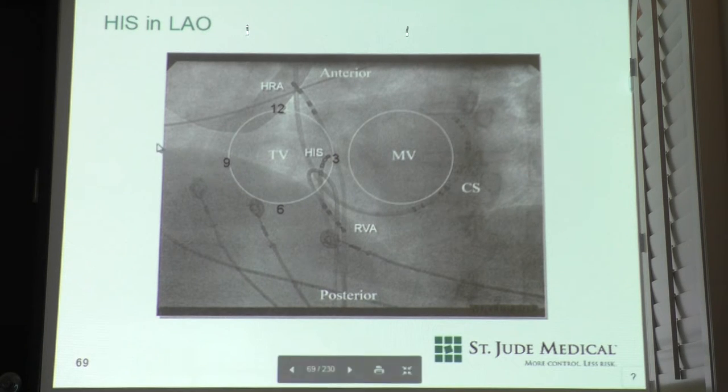And we have a couple catheters here. So we've got one, two, three, and then one more up here. Where's this catheter coming in from? These are coming in from the groin. That's easy, IVC. All the way down to the femoral stick. What's this coming from? Jugular? It is, or potentially the subclavian stick, right? Either one of those, a superior access point.